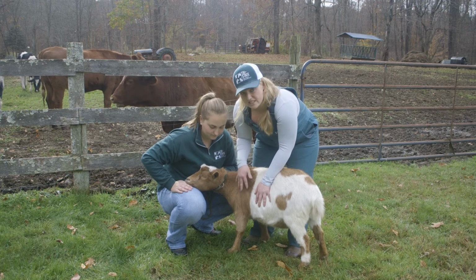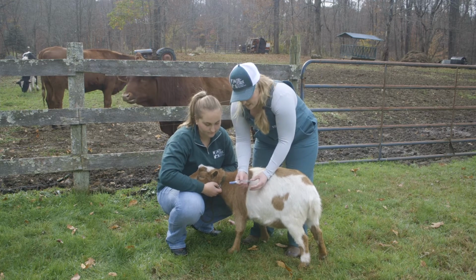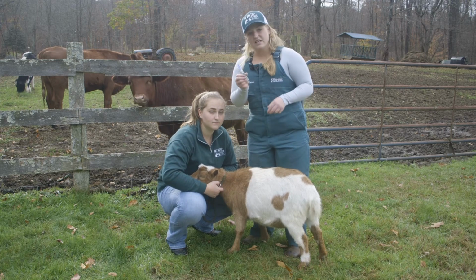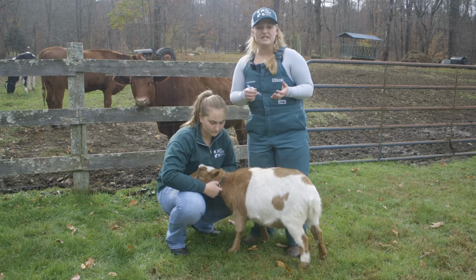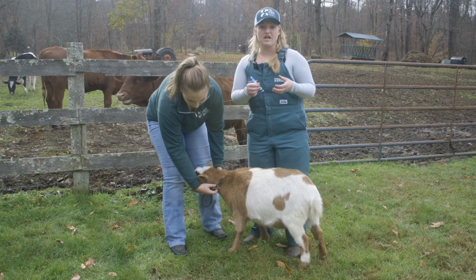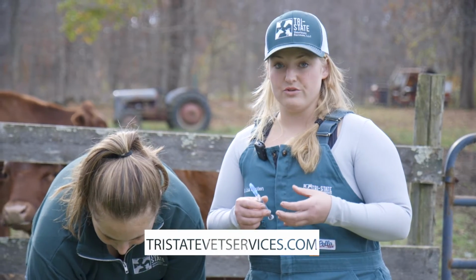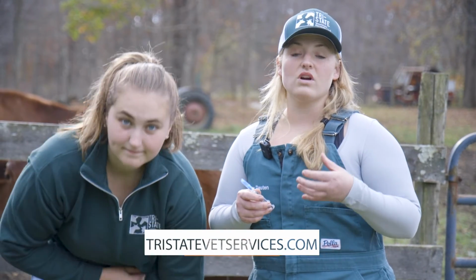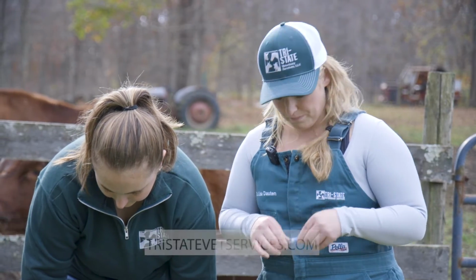No matter where you decide to give your subcutaneous injection, it's always important that your medication be using a clean and new needle. Why that's important is so we're not transmitting bacteria or blood or infectious agents from one goat to another. If you are giving medications at home and you need new needles, please contact us or your other veterinarians so that you can have needles on hand at home.